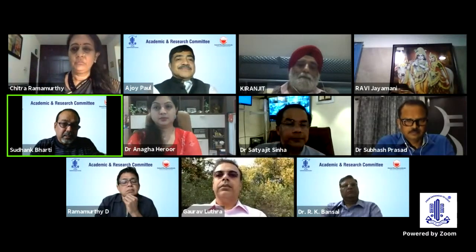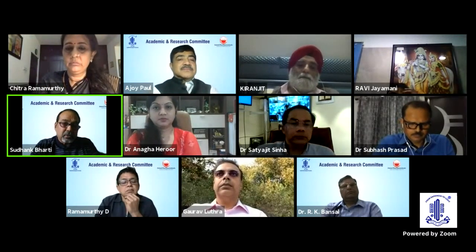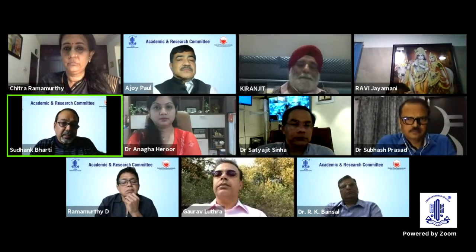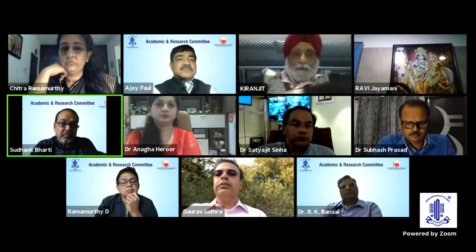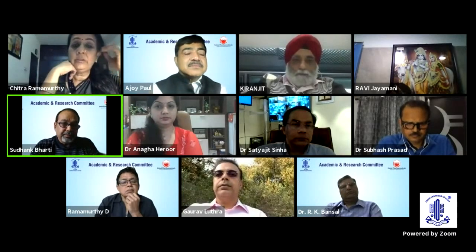So then in that case, rexis plays a major role as to how to place the lens vertically and nicely, because that rexis gives me wonderful placement of the IOL.